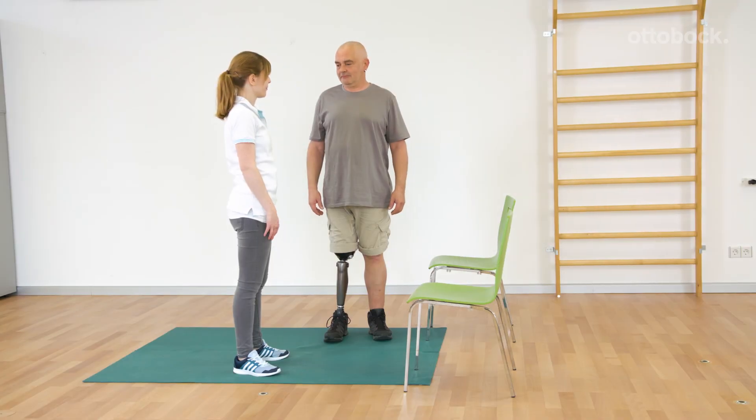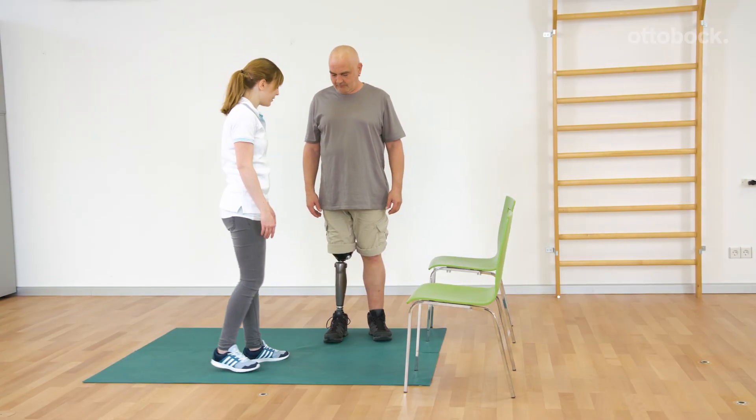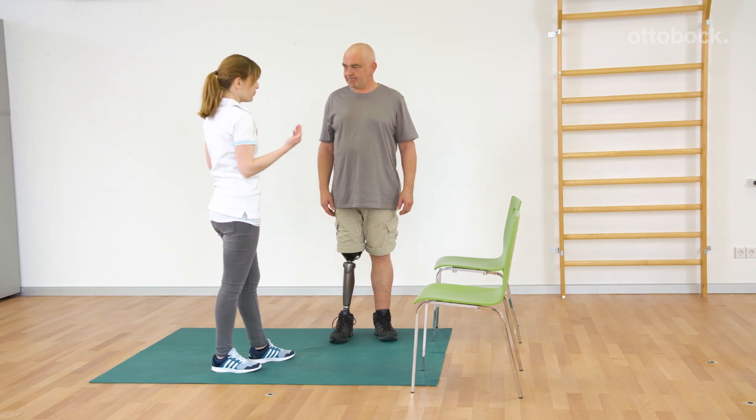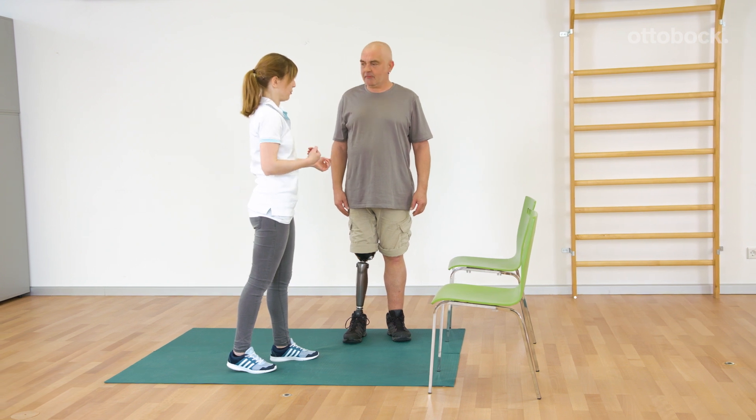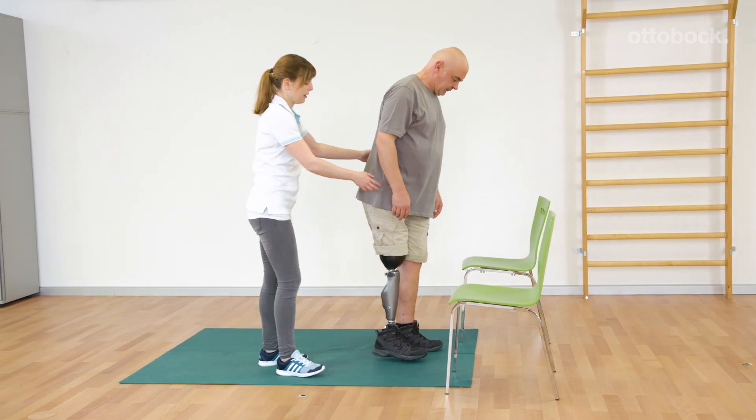Franziska and Gerhard showed different possibilities for going to the floor and getting up again. To make things easier, chairs are used for support in the beginning. The first method is to get up with an extended knee.